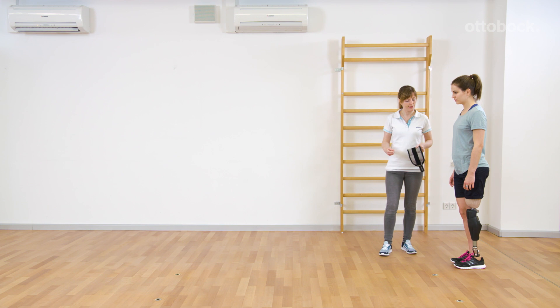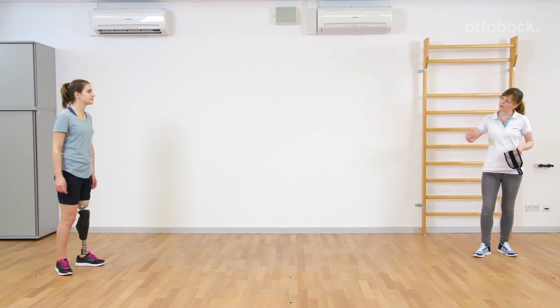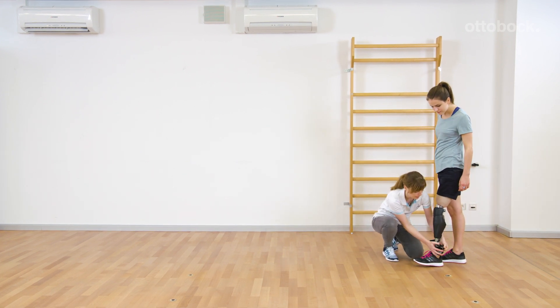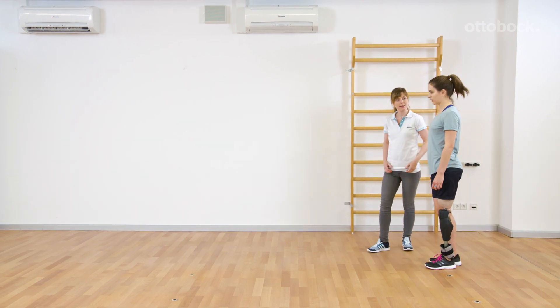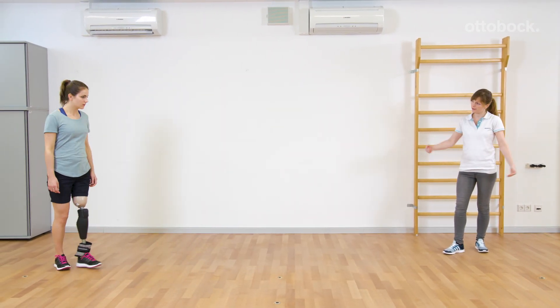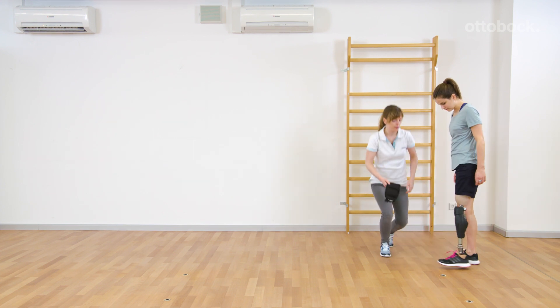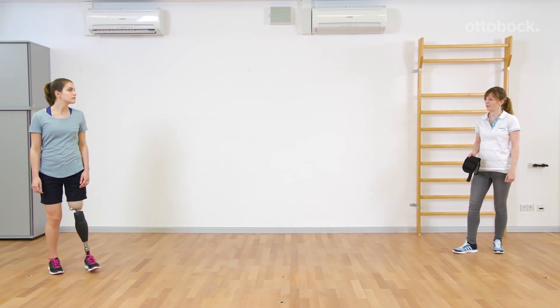Genium automatically adapts the swing phase behavior to changing walking speeds or changing weight of the shoes. Franziska uses an additional weight to simulate a heavier shoe. With fast walking speed, it's easy to notice that the knee joint just needs a few steps to adapt the swing behavior to the different weight. This adaptation ensures good toe clearance and an adequate position of the prosthetic knee joint before heel strike.